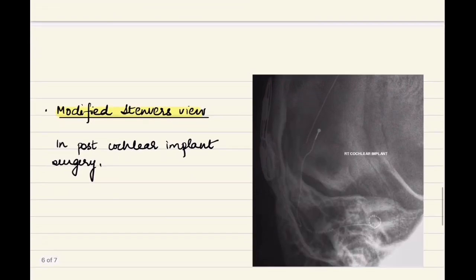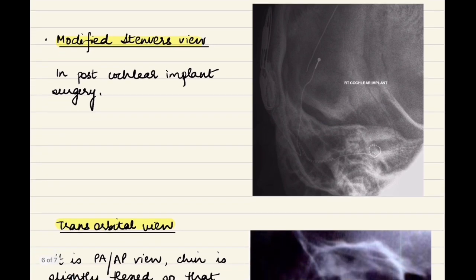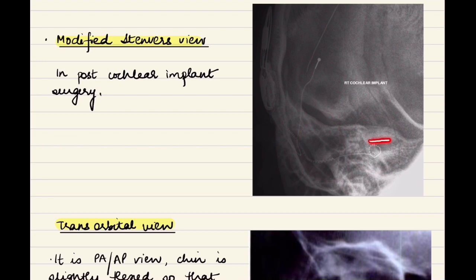There is a modification known as the modified Stenvers view, done to check the position of electrodes after cochlear implant surgery. In this view, we see more of the labyrinth and less of the mastoid air cells. On close inspection, we can identify the internal auditory canal, vestibule, lateral semicircular canal, superior semicircular canal, arcuate eminence, and the electrodes coiled in the cochlea.